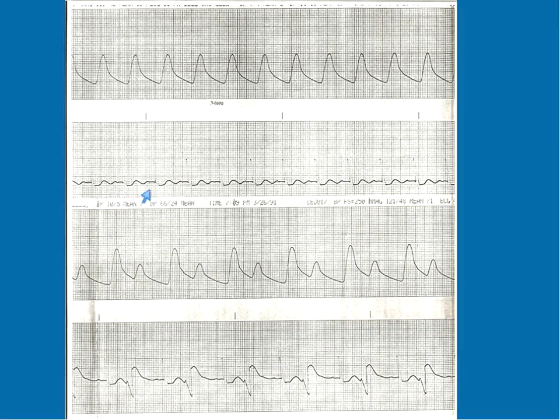Okay, so this one here is the ECG. If you look closely, you can see P, QRS, T. Now, the tracing has faded over the years. But see the top of the R? Top of the R, top of the R, top of the R. So just imagine that that is your QRS right there. By the way, there's a little bit of ST segment depression there, because here's my baseline. Anyway, R wave, R wave, R wave, R wave.